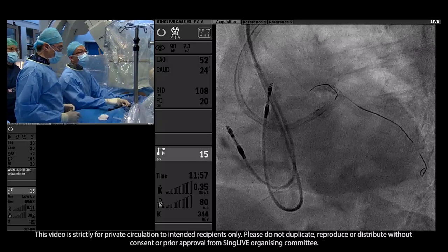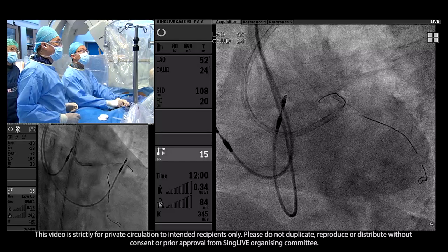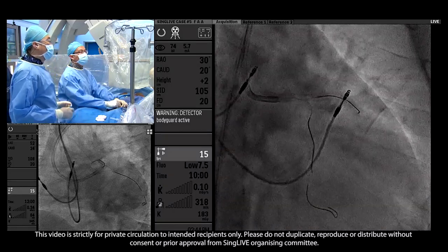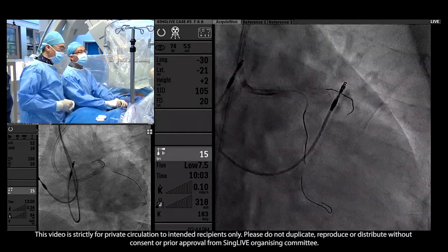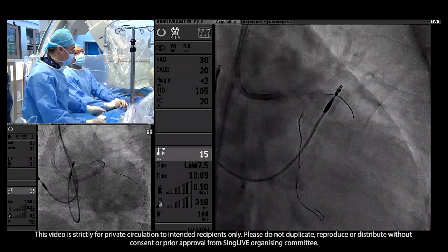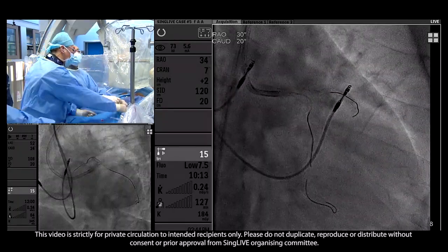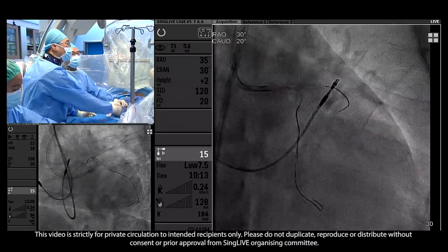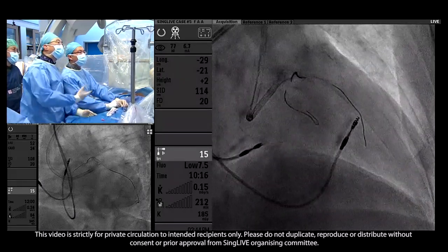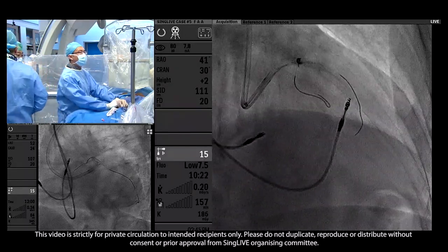The LAD wire, I have to push down a little bit. So when the circumflex first wire is removed, there's the possibility of deformation of the second stent, because that's the first wire on the side of the stent. Yeah, pull back the first one. Maybe go to a caudal or cranial view first. So the suggestion now is for the trap wire to be removed. Would the panel suggest that we remove the trap wire or use it as support to deliver the stent?